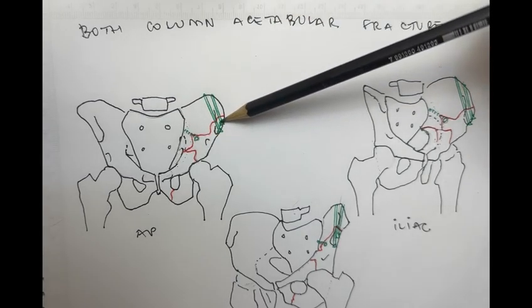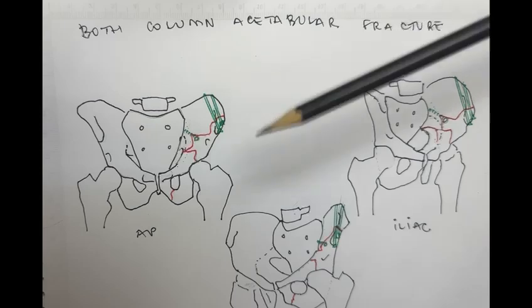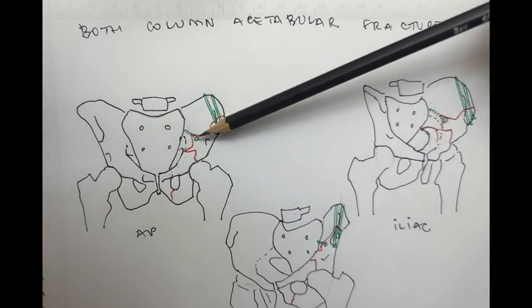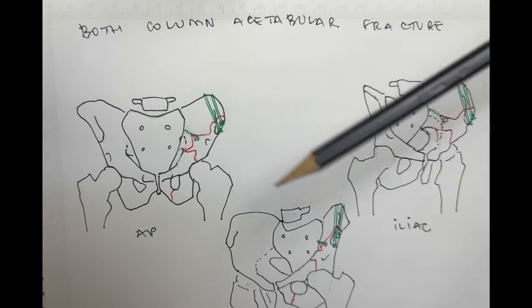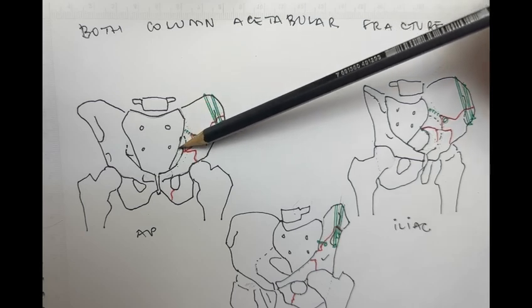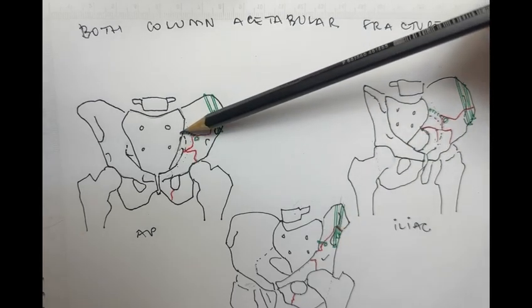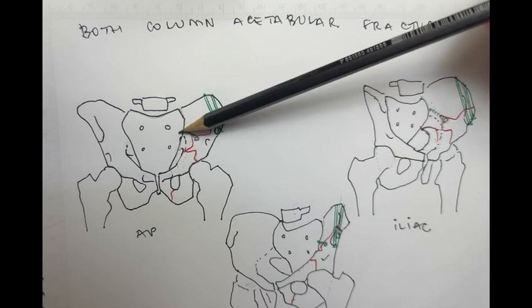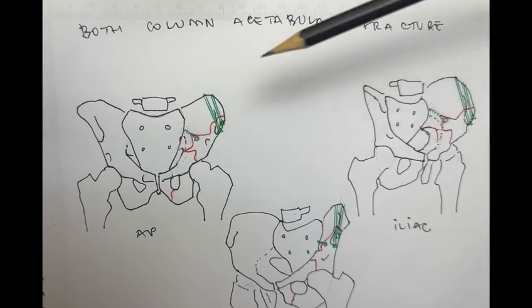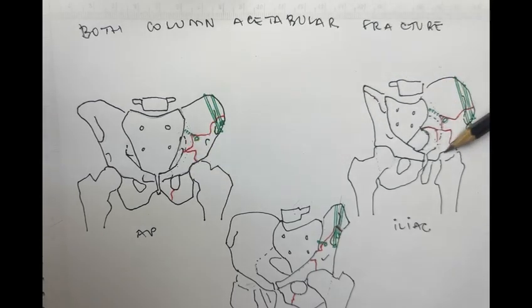So once reduced, we can fix with a plate, like on the top, or sometimes inside the pelvis, or just with some screws. I just put 2 screws here, and also here a screw to hold this reduction. It's important to remember that sometimes we can have an opening of the SI joint. So in this case, we should first of all reduce and fix, usually with a very short plate, to avoid getting in the way of the main implant that will go from here to here.